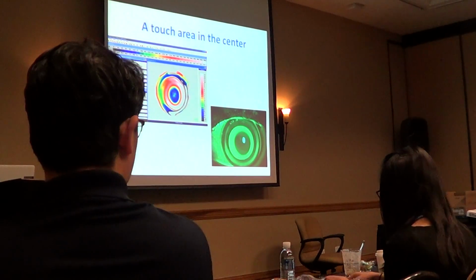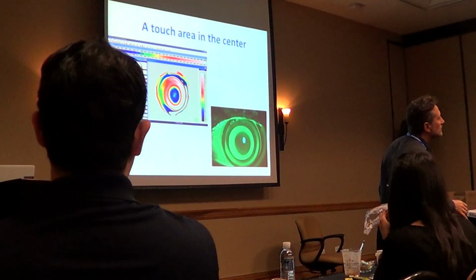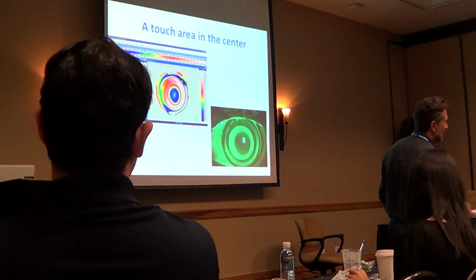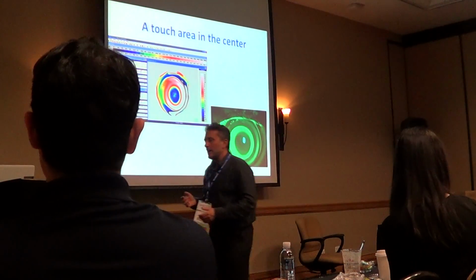Yeah, go ahead. And that lens is tilted. Oh, yes. Severely, too. The lens is tilting, yes. You'll get different areas of touch in the optic zone. Yeah, treatment zone as well.